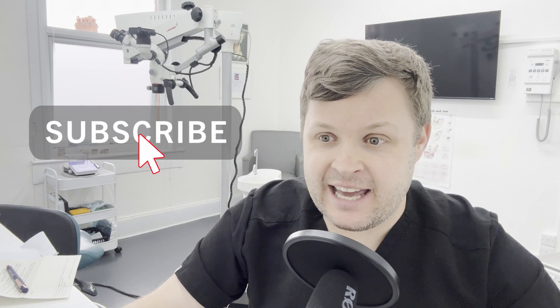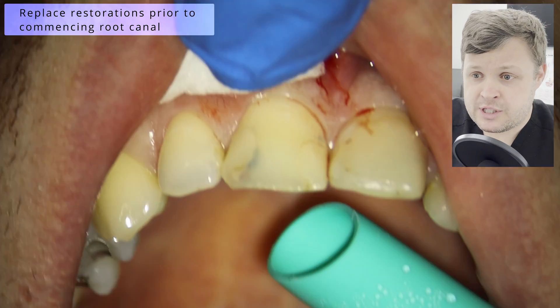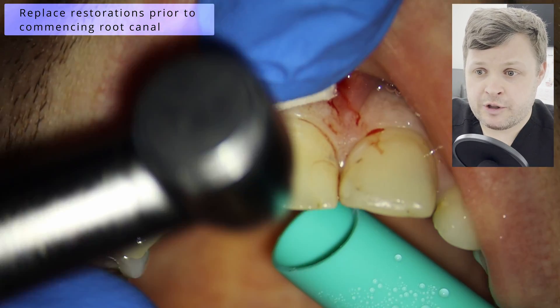Hello, welcome — another Friday, another video. This is a case of a large, very wide central incisor where we had to apically gauge and measure how wide the apical diameter was prior to obturating. We also had quite significant difficulty in drying the canal. As we get on with the case I'll explain everything, but overall you can see a super nice result.